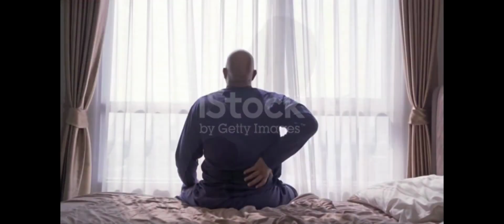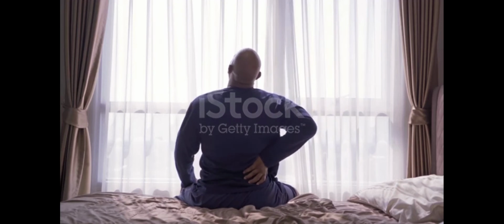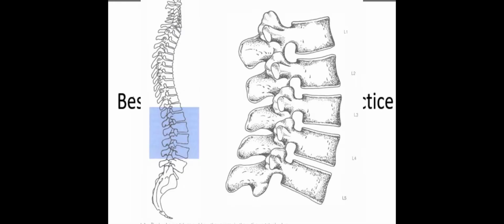Patients come to a department with an X-ray request form, where the indications are spondylolisthesis, lower back pain, neoplastic processes, osteoporosis, spondylosis, and the rest. And when we do it, it requires that we do a lumbar X-ray for them. What we do is AP and lateral, but today we'll be focusing on the lateral projection.